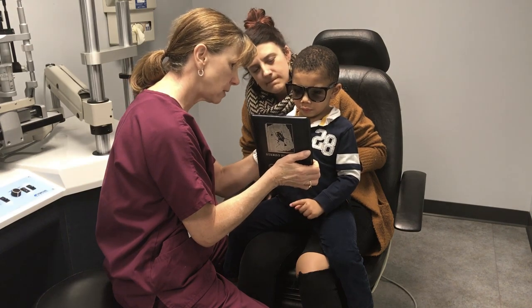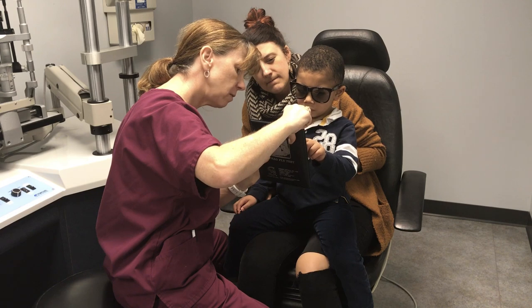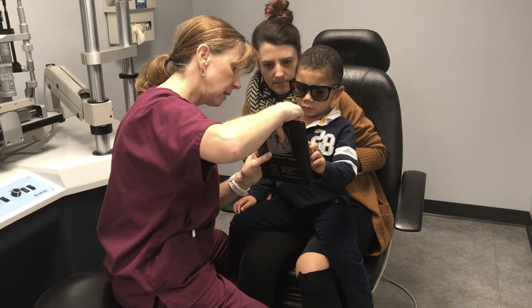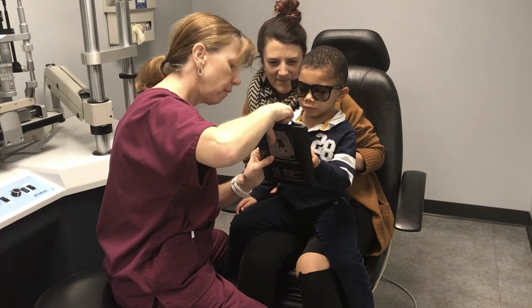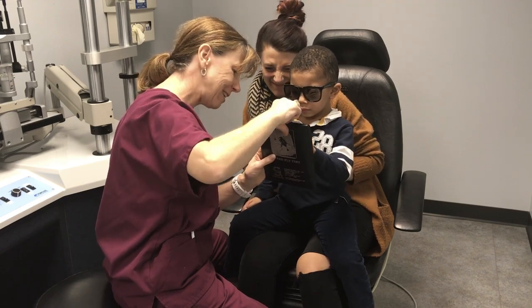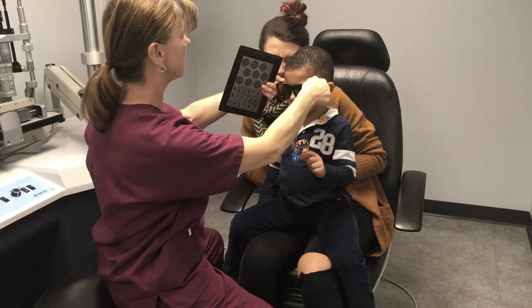Now, we have some dots up here. Look at those dots. Put your finger on the dot that pops out. That one right there. And then let's try these guys. Which one pops out? A little bit of all of them. Okay, let's do one more right here. Is there one there that pops out? Very good job. Let's take these off.